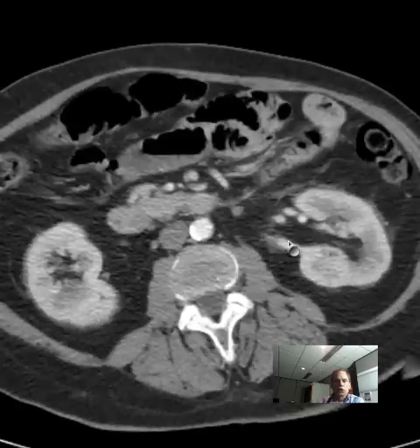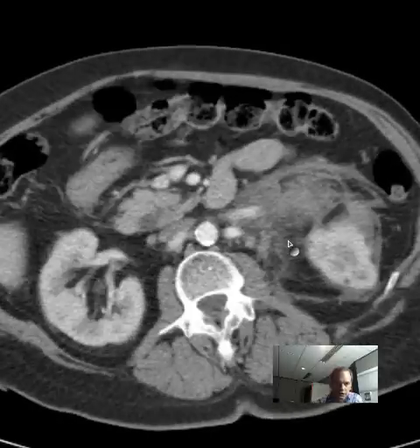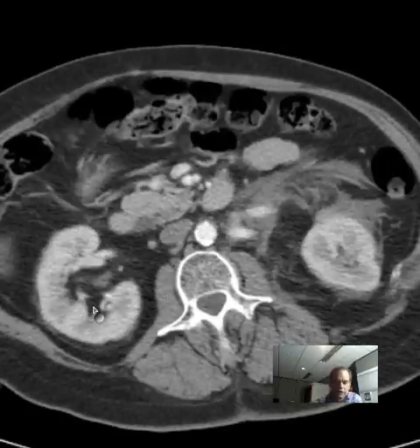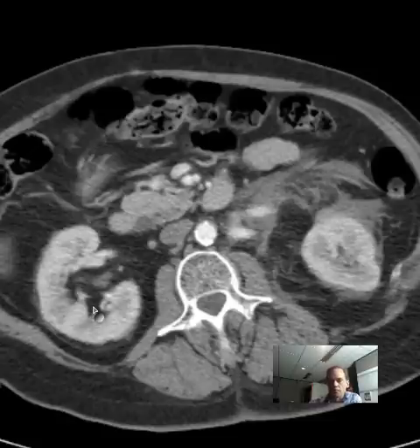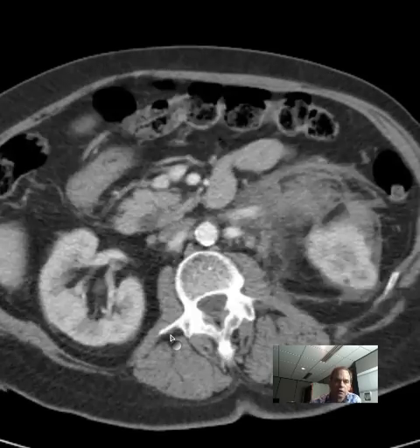Okay. So what is abnormal? There is an abnormality. What's abnormal? You kind of find yourself sometimes lost with where to begin. So the space that is involved is the retroperitoneum, and I think you can see that very clearly here. You see the kidney is a retroperitoneal structure. It is in the perirenal space. And you remember that there's an anterior pararenal space and a posterior pararenal space.